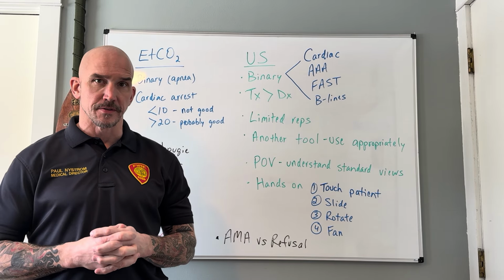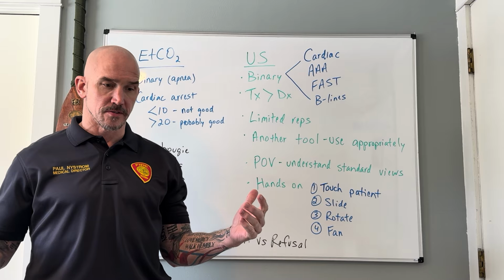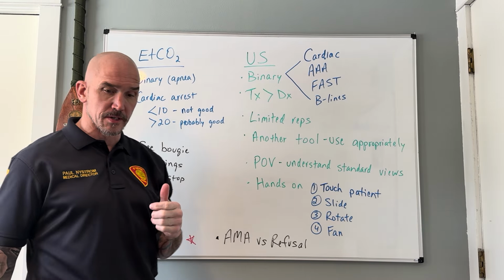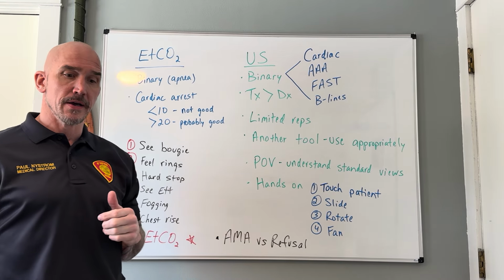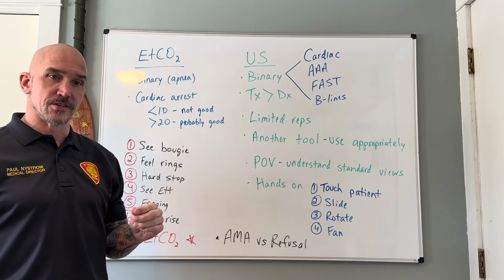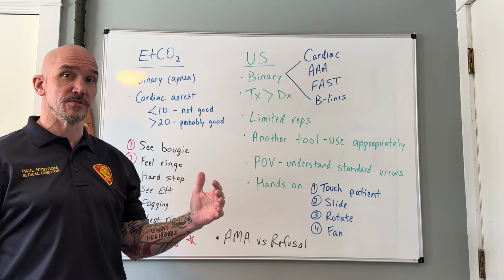Hello, today we're going to talk about the summary from the January EMS training. We covered a wide variety of topics, so we'll talk about all those briefly. One of the main things that we looked at was end-tidal CO2 monitoring. We looked at a PowerPoint, which Sean is going to share with you. I'll also attach an article that has sort of the best summary of the details of using that.